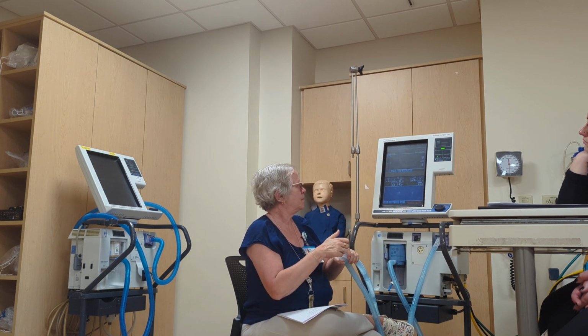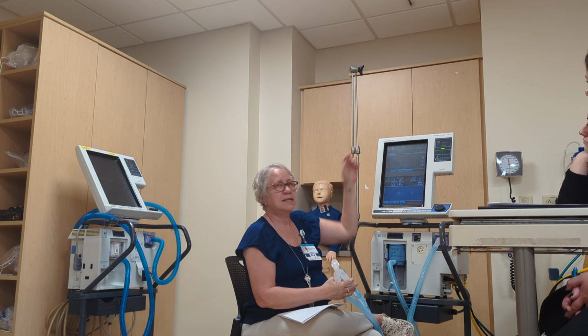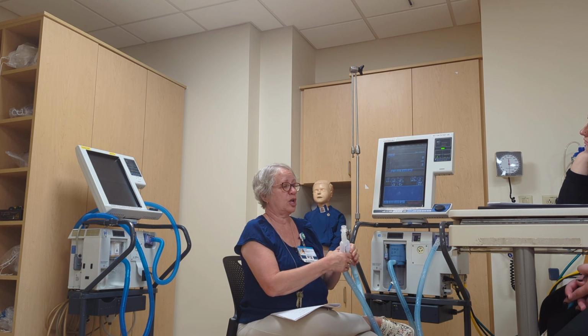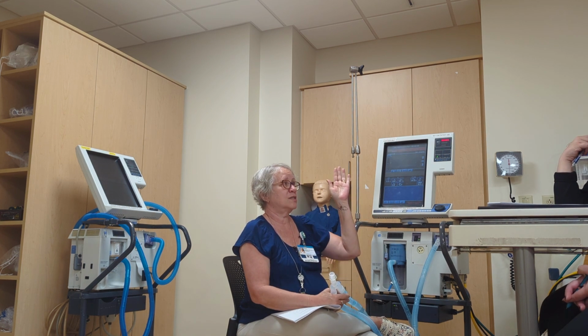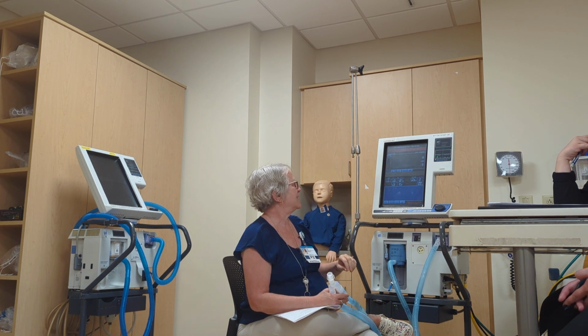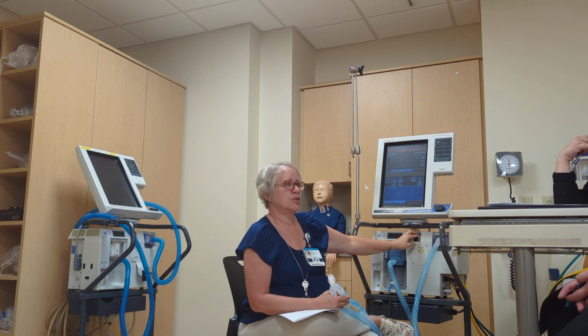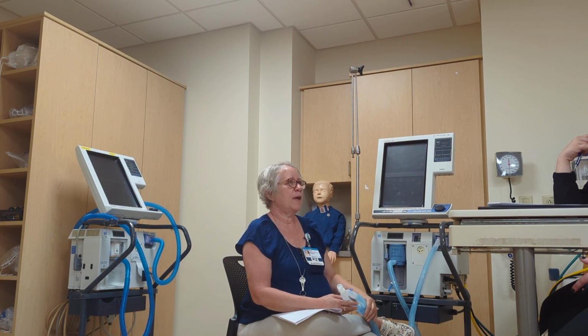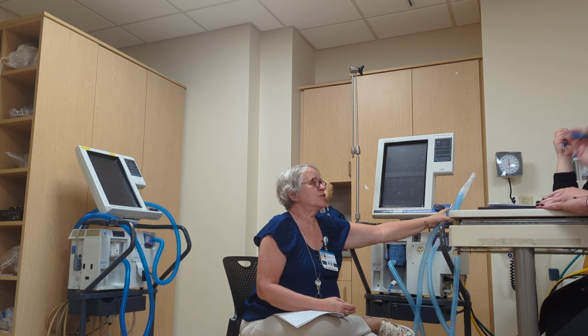Okay, ready? 69. That's your change in pressure. I occluded it. So C equals V over P. 200 divided by 69. Go ahead and do your math. Who's going to do the math? I'd write it out so you know what you're doing.